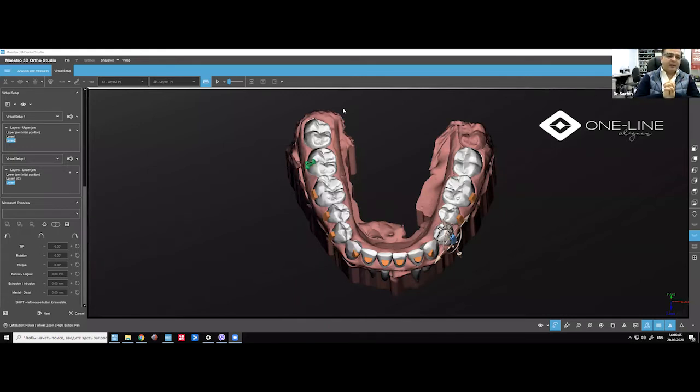How many teeth? You can move actually all teeth. It's not just one tooth. You need to have space and you need to have coverage, you know. The aligner should fit. If the aligner will not fit, it means you cannot put it for all the teeth, right? So the movement depends on the space which you have to fit the aligner, which is very important to understand.